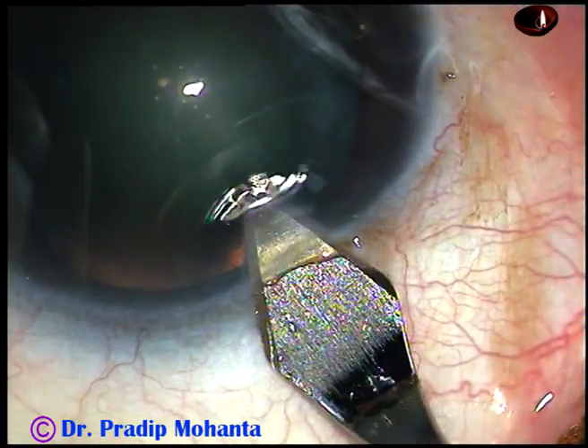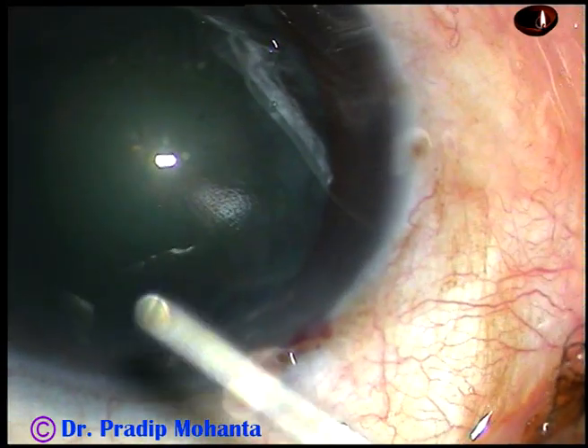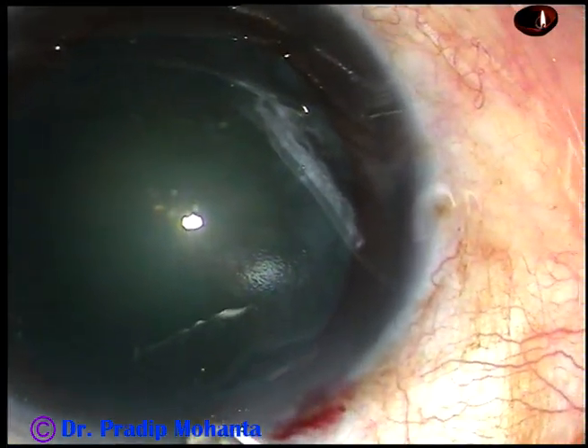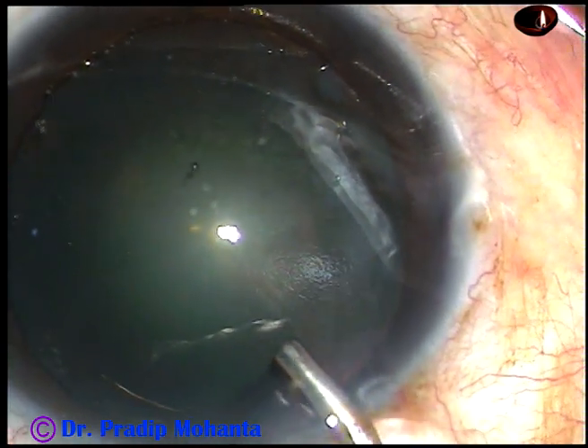This is the main incision at the posterior aspect of the limbus. Now, viscoelastic substance, 2% HPMC, is injected into the anterior chamber.